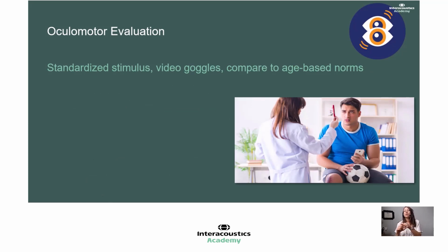And oculomotors are evaluated by many different professionals on a concussion management team. Most of the time, it is performed on a bedside aspect, and that's because, maybe they're on the sideline of a soccer field, or they're in an area where they don't have quick access to video goggles. But the benefit of a vestibular audiologist or a physical therapist who utilizes video goggles is that you are providing a standardized stimulus every single time.